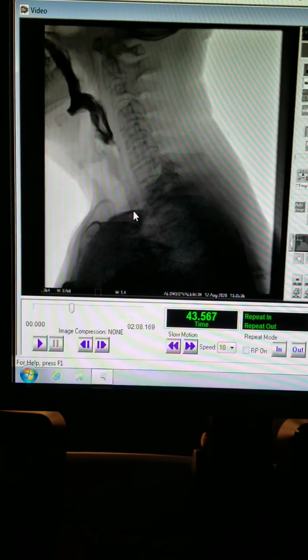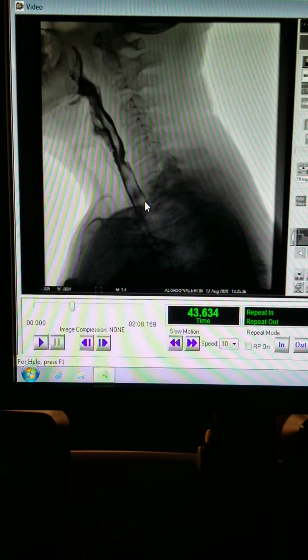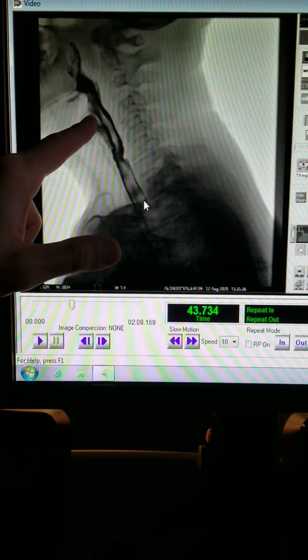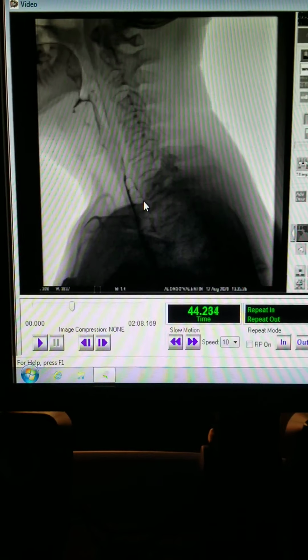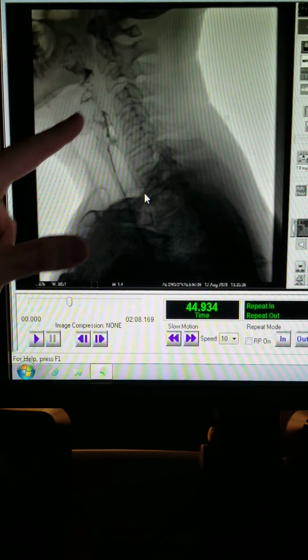And so this is the reason you have to flush everything, right? Take lots of liquids to get it down. Again, here's another sip to rinse, but the same thing. A little bit of liquid sneaks in beforehand, and that's because of the delay. See it a little more pronounced here.